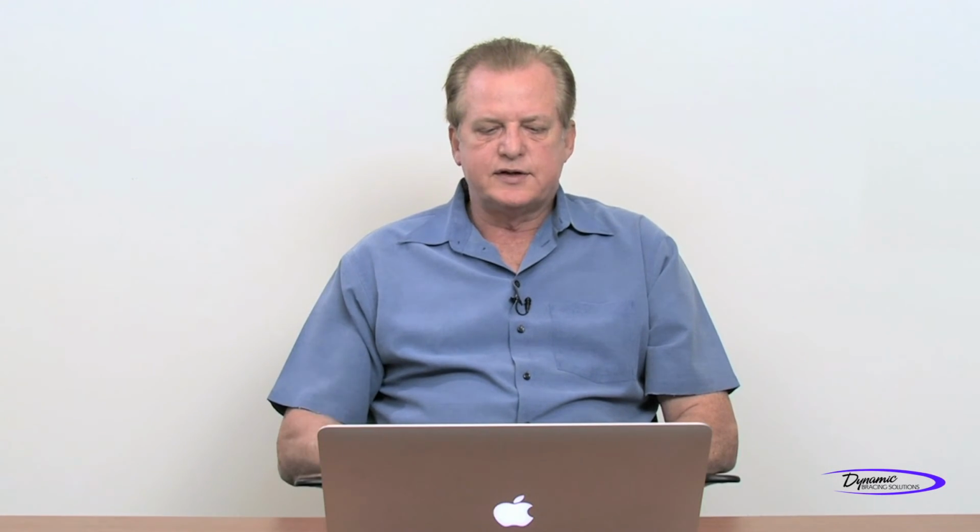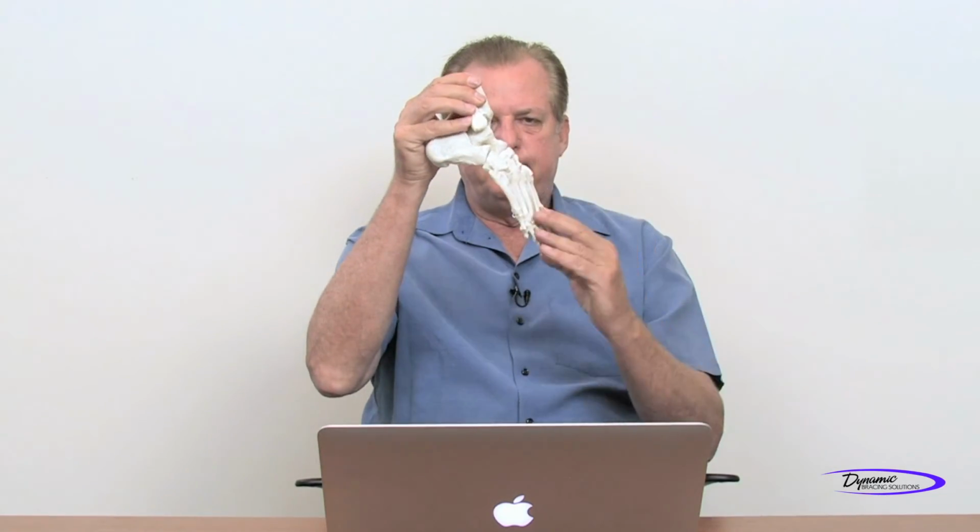The other part of the primary goals of an orthosis is to support body segments. If we have something that is injured or needs support, we need to support that body segment so that it is protected and can heal. Replacing functional deficits is another primary goal of an orthosis. If we have a drop foot, our goal is to find a functional replacement for that drop foot by bringing the foot up and supporting it. If there's lost propulsion, that's a functional deficit, and if we could replace that, it's a functional need of that individual. A drop foot is not a structural deficit. It is a functional deficit.